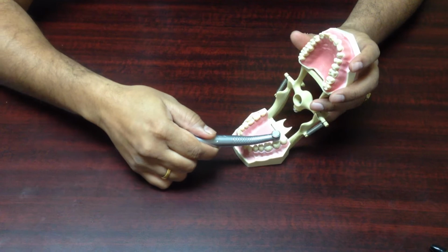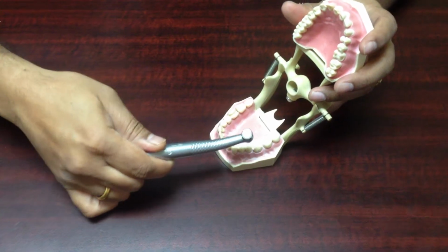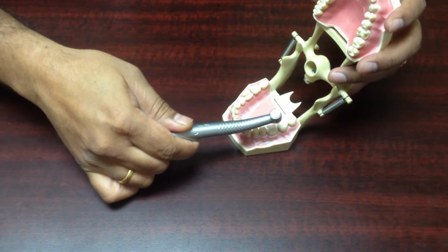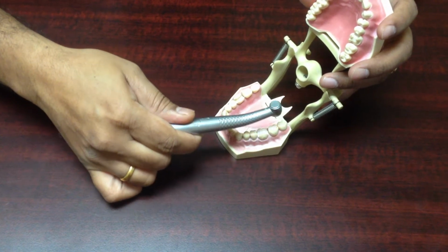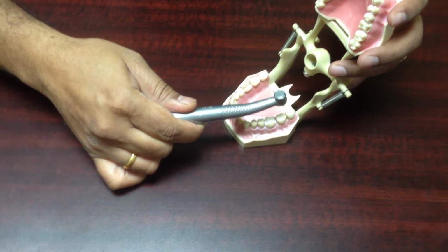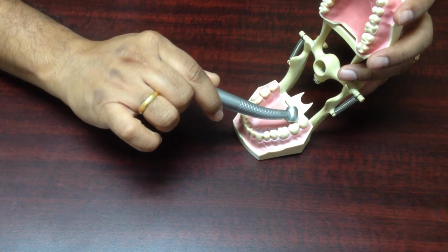So anyways, my idea is to somehow align this with the teeth with some sort of mountable hardware, where this gets clipped onto the hardware, and it slides into place, and it scans the tooth over, and it'll kind of go around like the current technology we already have. Before it's even prepped, we call it prepped, when it's in the intact phase.